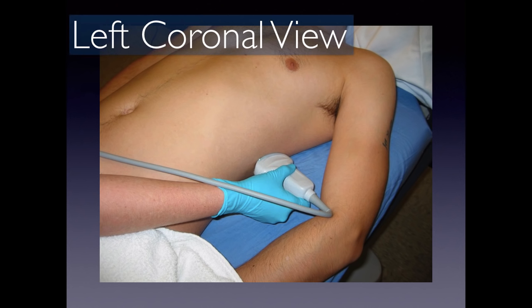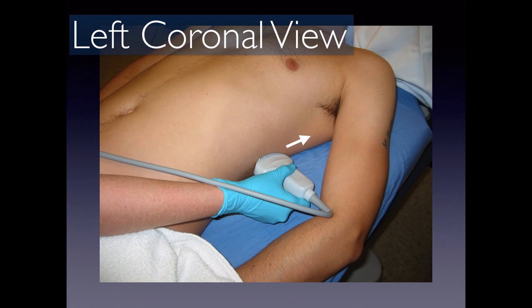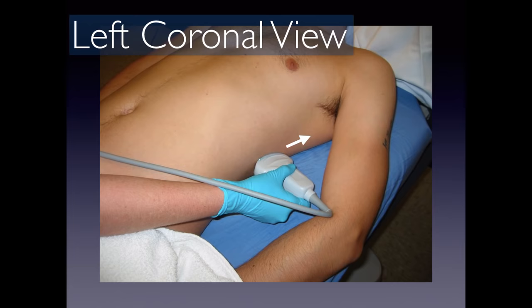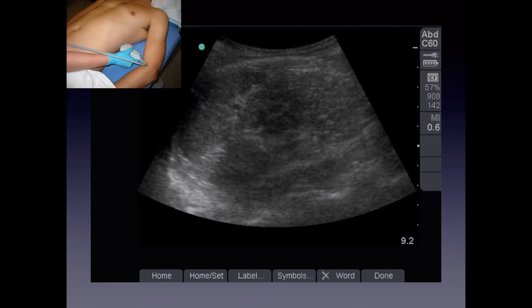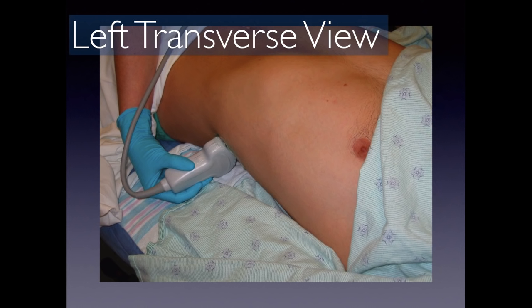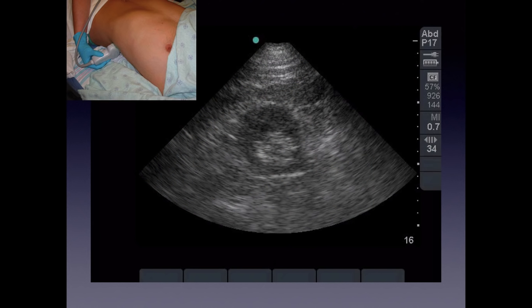Moving to the left kidney, the technique is very similar with the indicator towards the patient's head. Both coronal views have the probe slightly oblique to get the most longitudinal view of the kidney — you can play around with that. On the left side you see the spleen rather than liver, which is smaller. For the transverse view, the indicator is up towards the ceiling.